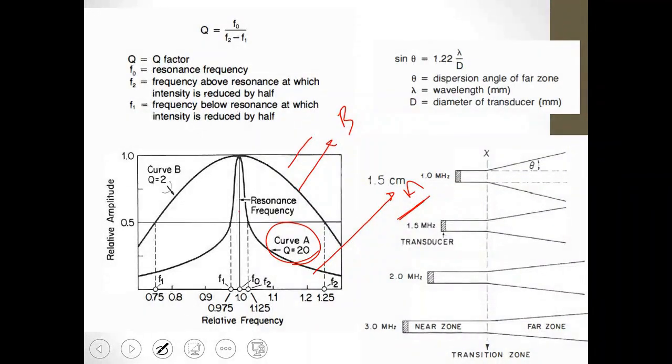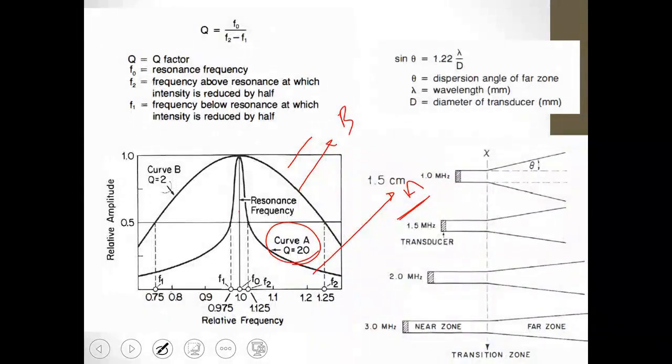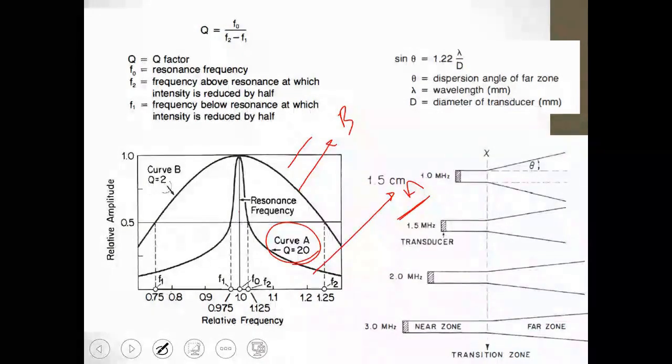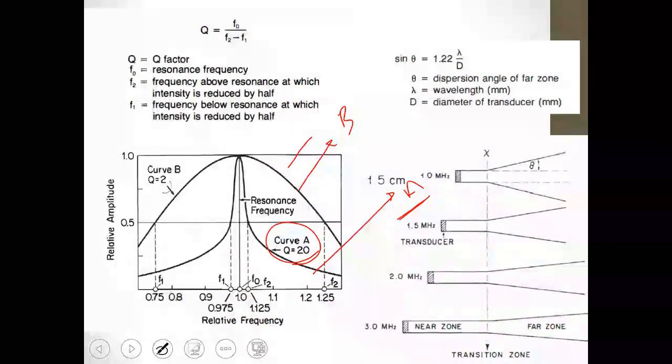High frequency, Dr. Islam, means that the ultrasound pulses will interact significantly with the tissues and cells inside the patient's body. This enhances the attenuation of the pulses. When the pulses come at high frequency, the interaction between these pulses and the cells increases, leading to a loss in intensity.